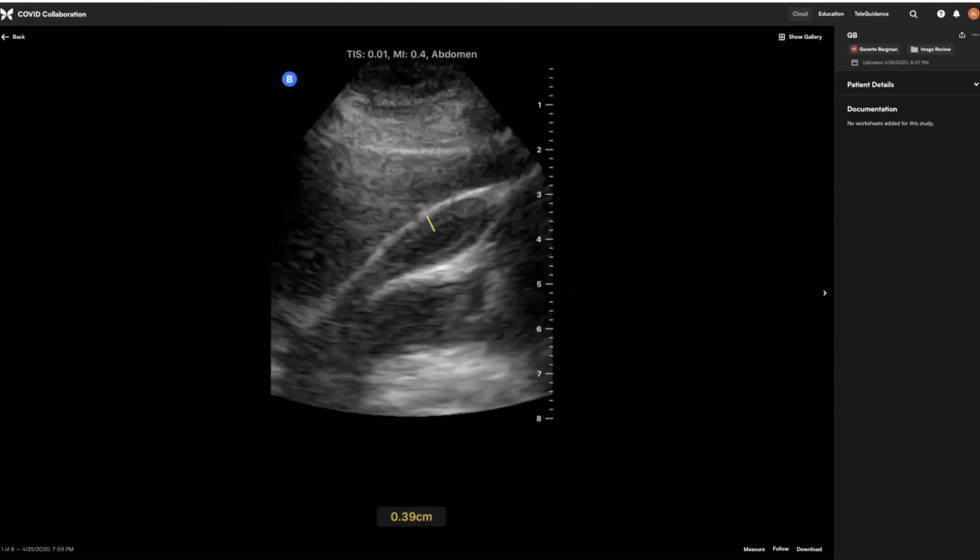This is a gallbladder. I don't know if you can make out the gallbladder borders here. And I think they were instructed that they had to image the gallbladder after they had eaten. So they had to deliberately find their contracted gallbladder, which I think this is a pretty great view of. It's relatively small. The lumen here is relatively small. The wall looks thickened just because it's smaller.